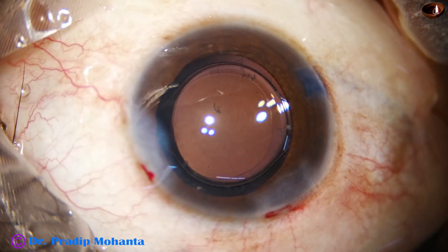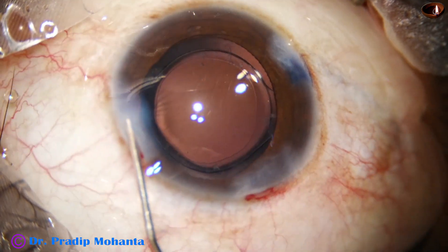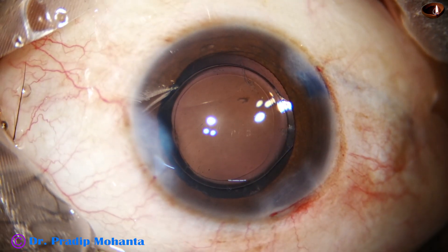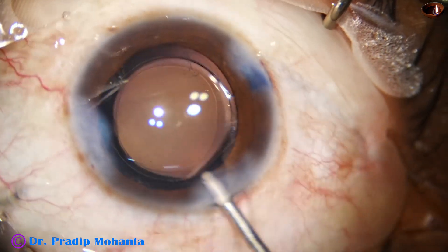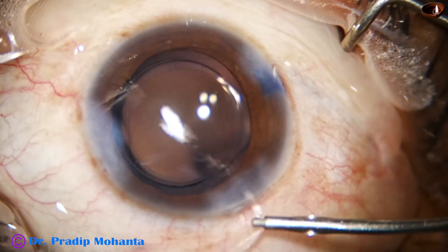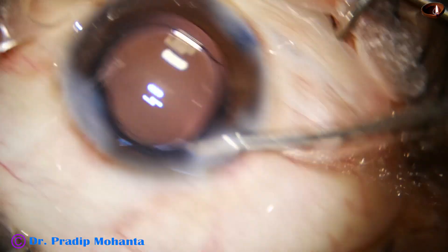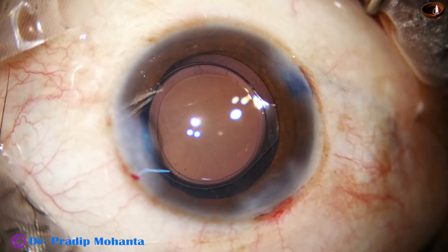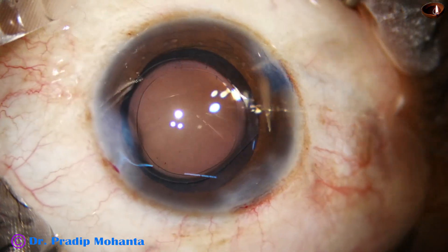Here is a bit of moxifloxacin. Then I close the side port again — I am hydrating because the left wound was leaking a bit. Now this is the final lavage, and this is the way I form the anterior chamber: one flow goes inside and another flow goes outside, and give a forward and upward push of the anterior wall — you will see that the wound is nicely sealed.